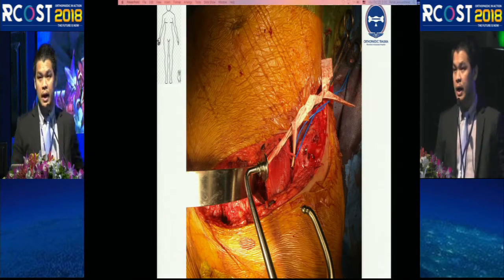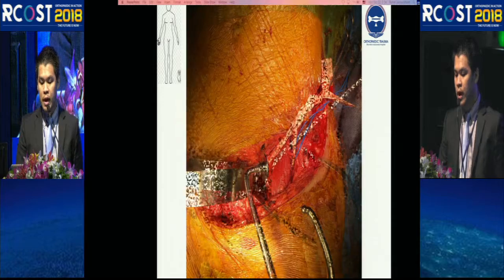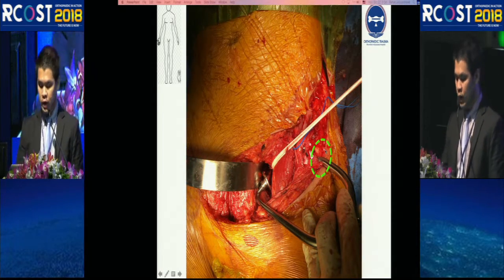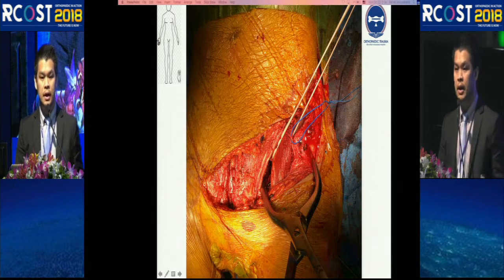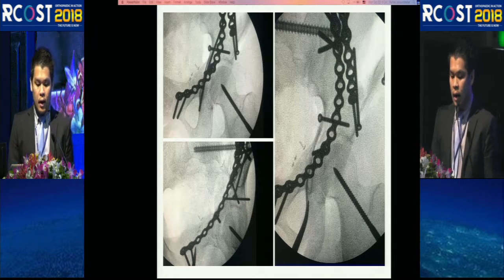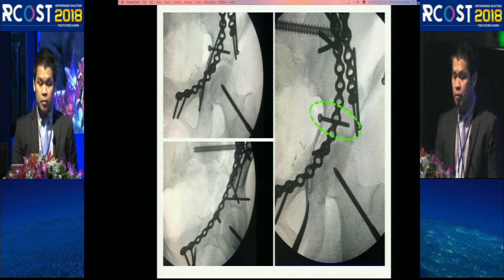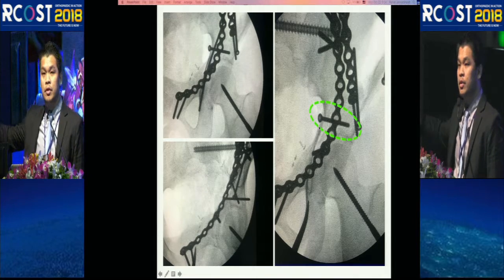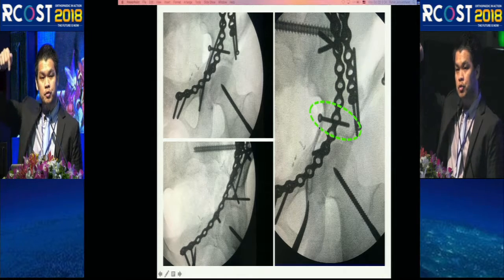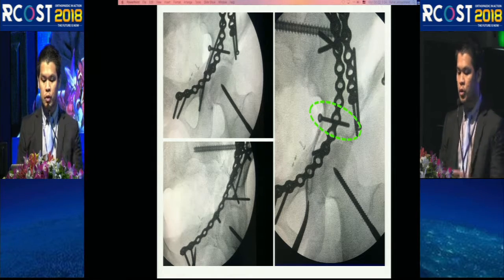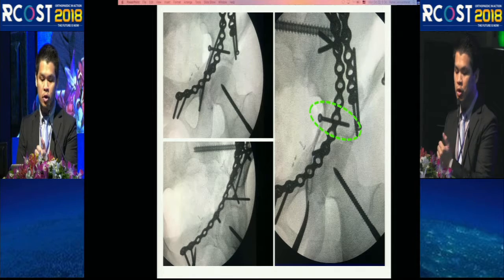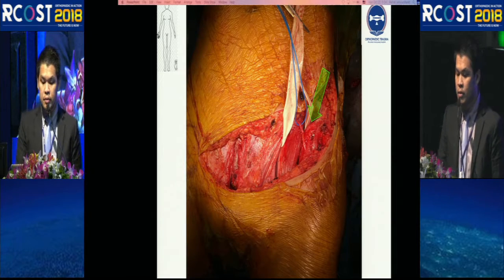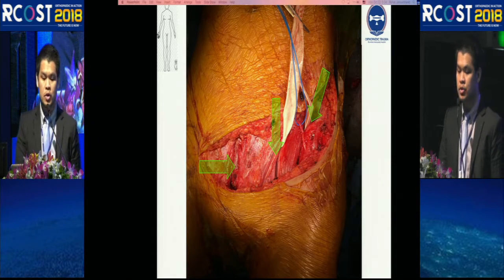A common question is how to apply this clamp. You make a percutaneous incision to insert the tongue first, then bypass the soft tissue to insert the other clamp inside to squeeze. After reduction, I need the Stoppa approach to place a lag screw — because the fracture is a very shearing type and difficult to fix from the top. With one lag screw the posterior column is reduced, and then a long posterior column screw completes the fixation. This shows the lateral window, second window, and Stoppa approach incisions.